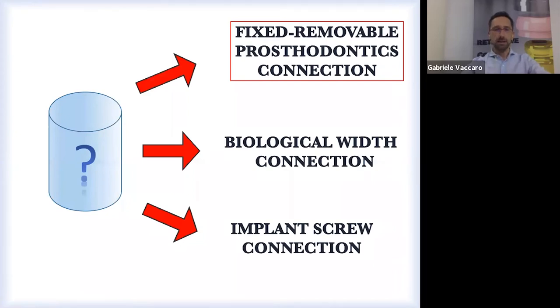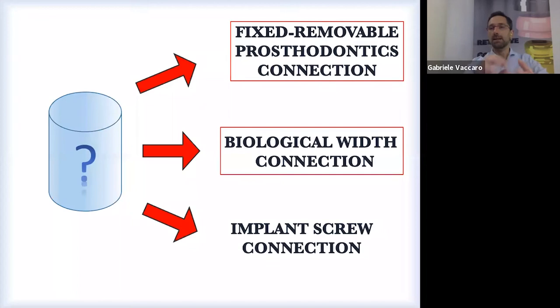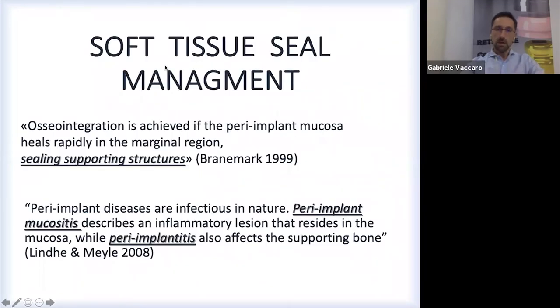The other part, and it's very important, is the biological width connection. Since most of us are using bone level implants, everything we put over our implant crosses through the gingiva, through the mucosa. This means one thing, that around our abutment, we set up the biological width connection. What do I mean by this? With the abutment, we are ruling the management of the soft tissue seal. And what is the soft tissue seal?